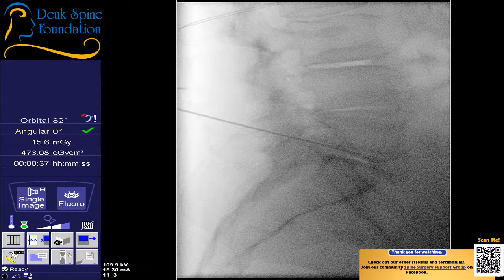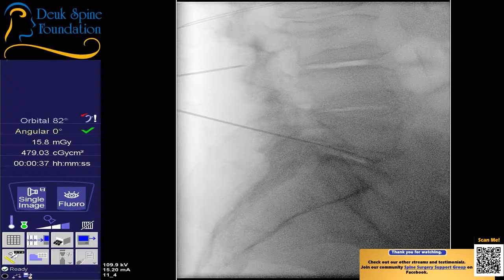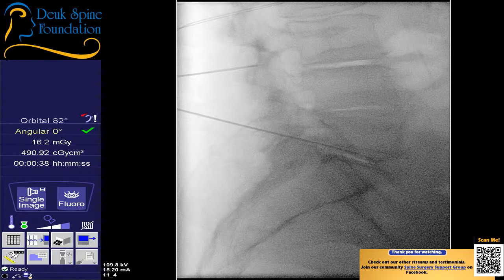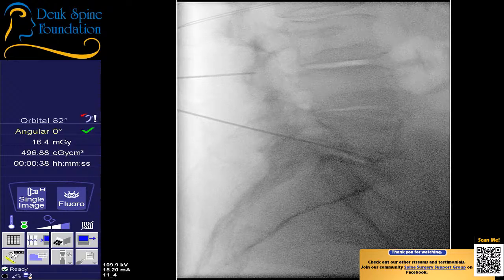The only problem is I don't know if I can get there. All right, so we make an incision. We get all 3 of our positioning needles in place. And then shot. And then we put the patient to sleep. So we're not quite ready yet. Shot. It's a little higher than I want to be. Shot. That's better.